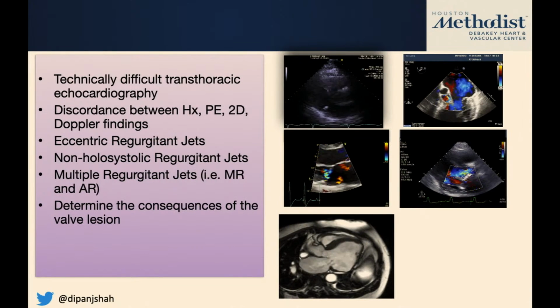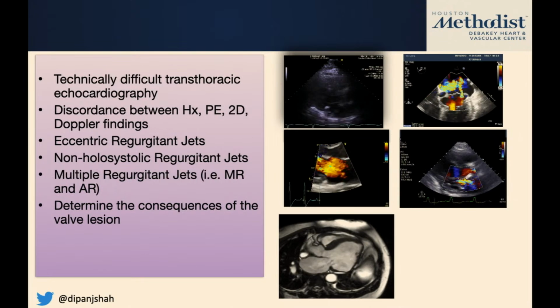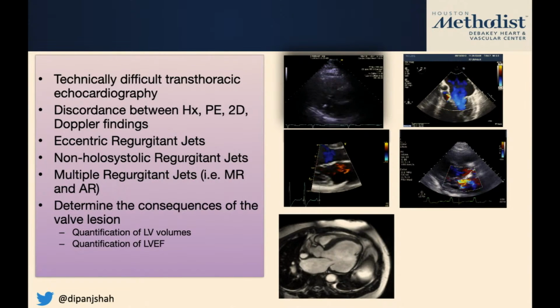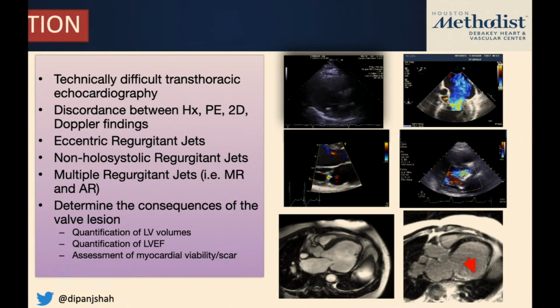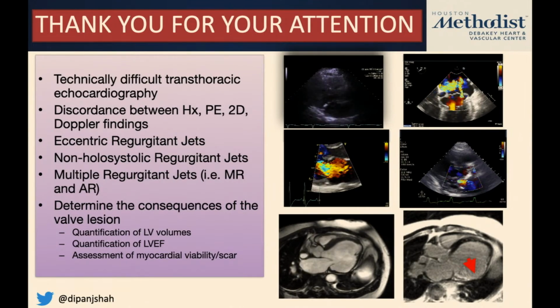And then, importantly, even when you know the severity of the lesion, you may want to accurately characterize the consequences of this valve lesion on the heart, both from a standpoint of quantification of volumes, of ejection fraction, also of assessment of the right heart, and then lastly for assessment of myocardial viability and scar. So thank you for your attention, and I'm going to open it up now for questions.